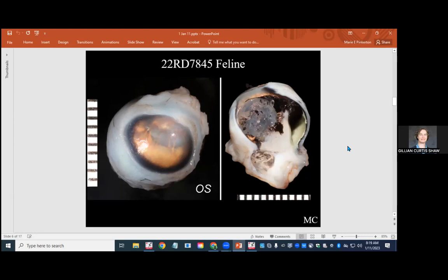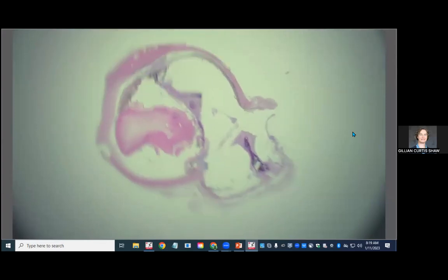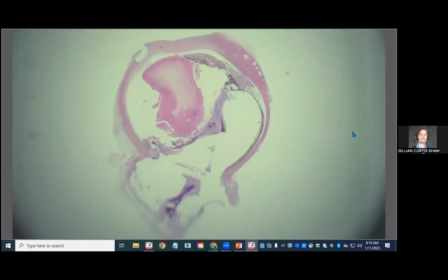See if I can give you a quick subgross view, and we should probably switch over to this. There we go. We'll set it up just like this because that's how it was in the gross view. So we have that little bit of cornea right here, and this side is kind of that more well-formed side. We do still have that nice well-formed iris leaflet.